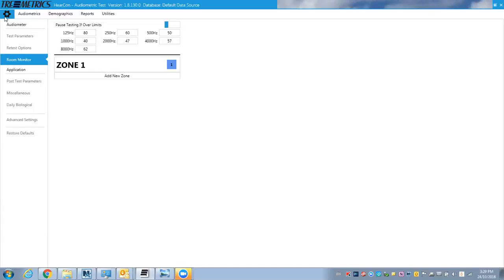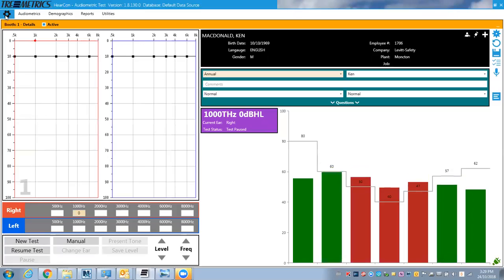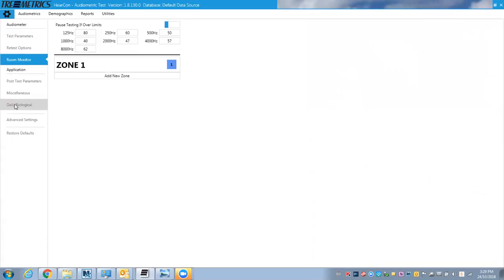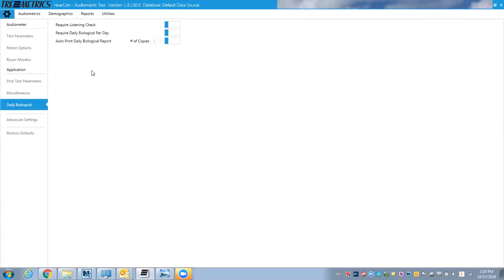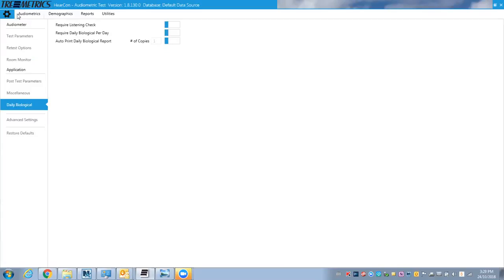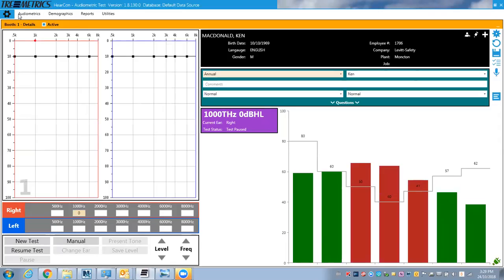Also under the settings, you can get into the daily biological. Built into the RA-660 is a bioacoustic simulator to test the headphones. So you can require a daily listening check or a daily biological. So let's actually go back to this other screen here.